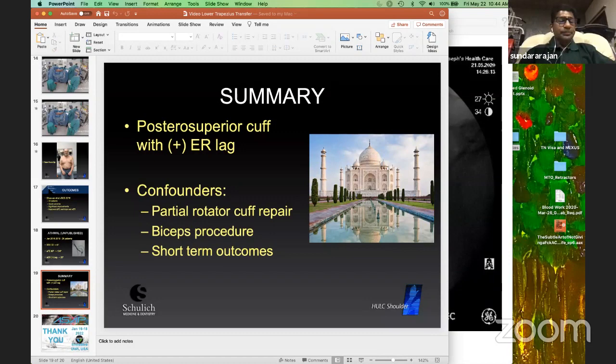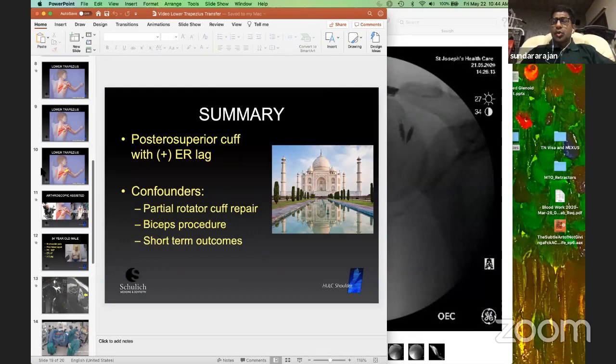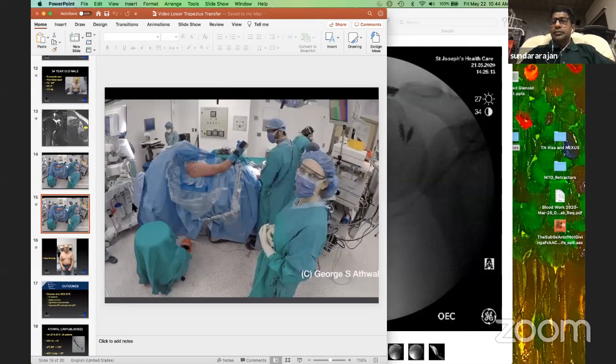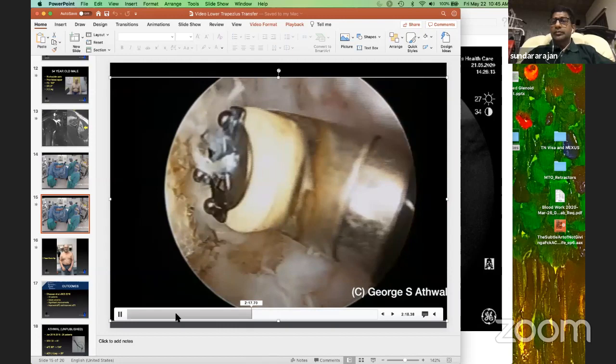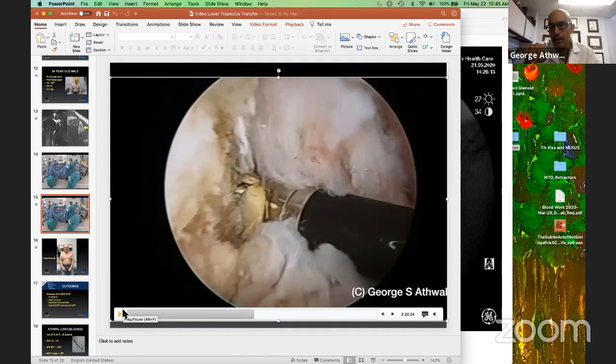For sure. George, I think the tunnel exit is more on the anterolateral aspect of the proximal humerus, isn't it? Is the quality of the bone a concern when you use an endobutton? So what I try to do is always have the exit through the biceps groove. If I miss and it's in the tuberosity, or coming out the greater, if it's a younger person, I'm okay with that. If they're an older person, I'll reorient the guide pin until I'm directly in the biceps groove, because that's the best quality bone for the cortical button for me. I just don't want the cortical button to fail. So it is a concern for me, and that's why I do it in the biceps groove.